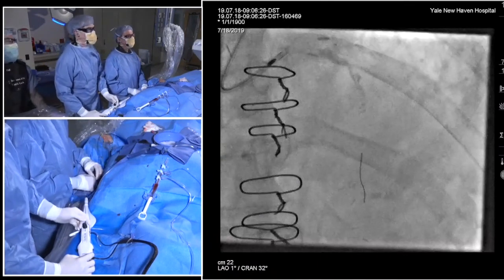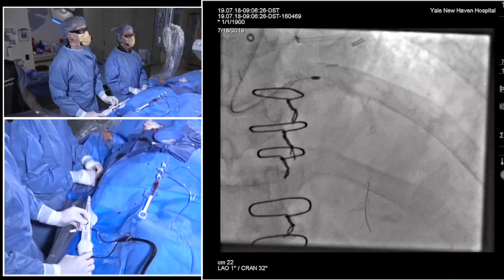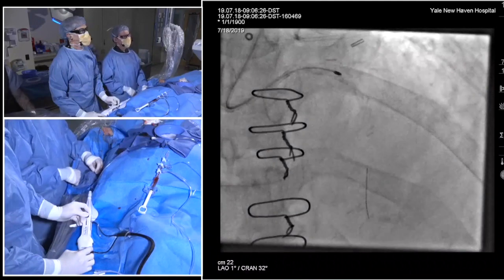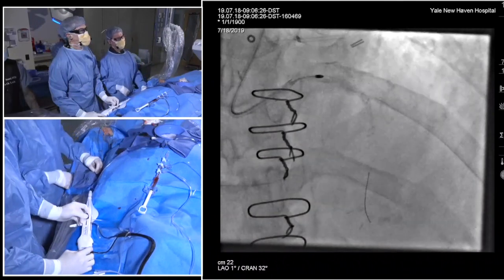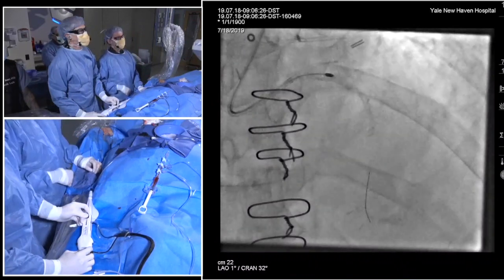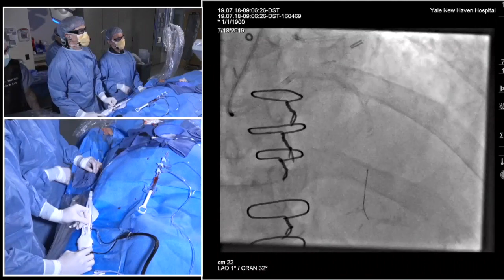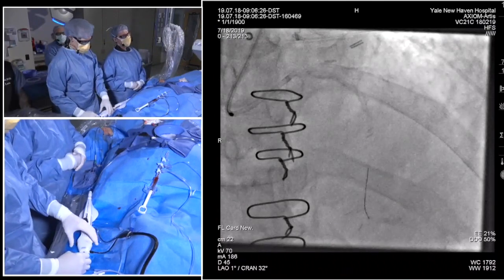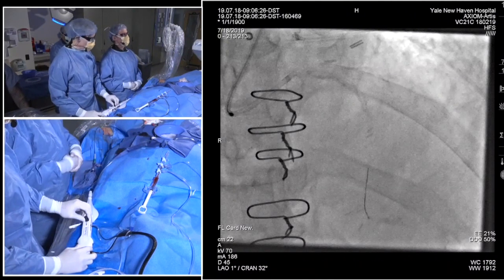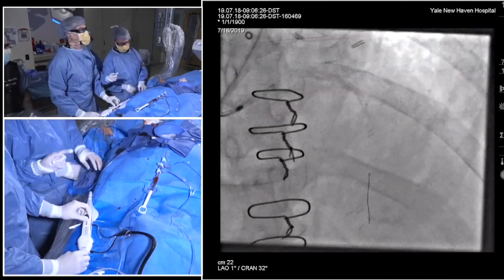Hey, Steve, I have a quick question for you. Obviously, there are different devices for atherectomy in the market, and perhaps you can comment on your thought process behind choosing one versus the other, and highlight the properties of the Rota in this specific case that made you decide that way. So, Carlos, I'm an old Rota guy, so you go with what you're most comfortable with and most experienced with. I think the CSI device has been great, but something like this is ideal for Rota. It's a really long lesion. You just want to be able to make a channel through those angles up front and get access to the distal LAD so you can get a nice balloon inflation.